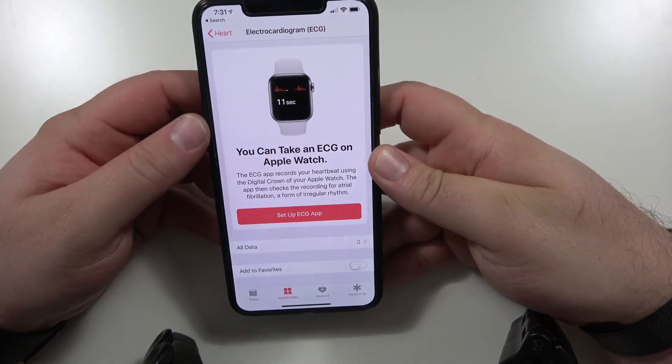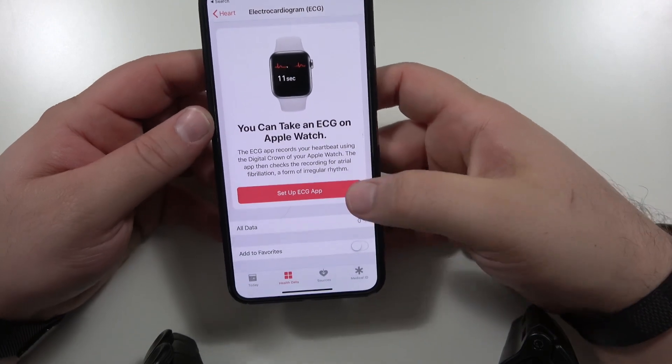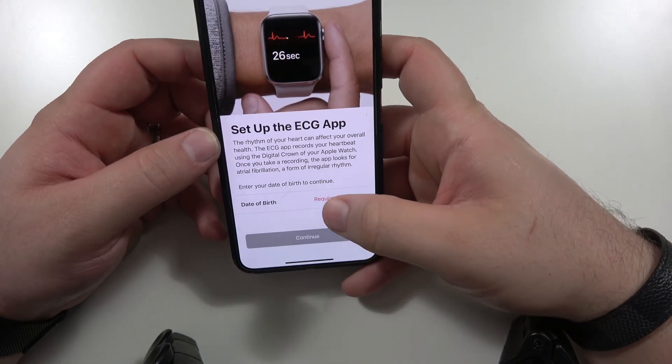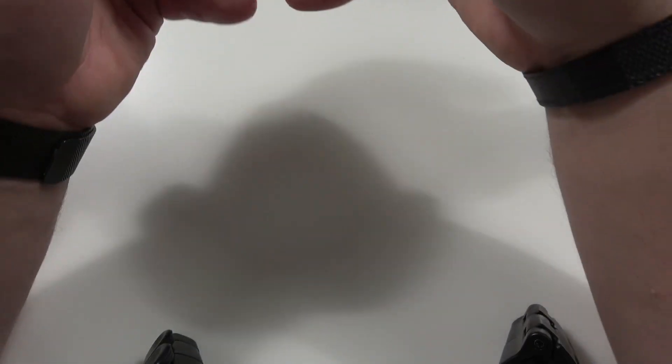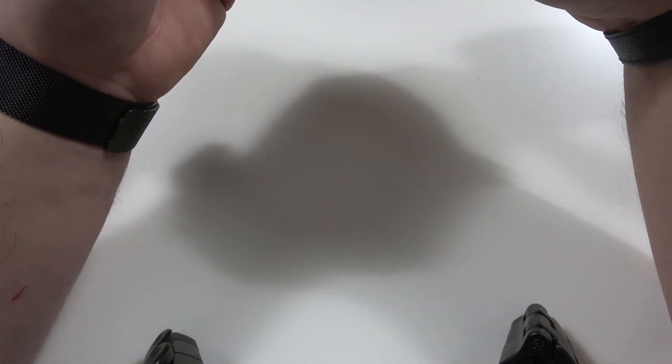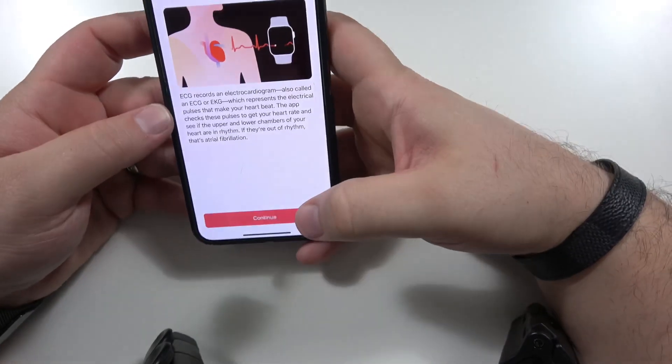All right guys, here it is. We're gonna set up our EKG. It's required to put in your birthday. You don't need to know how old I am — I'm not telling. I'm 25, if anybody asks. All right, so there we go.